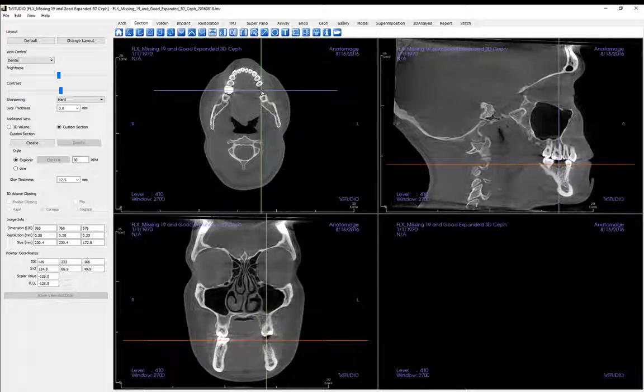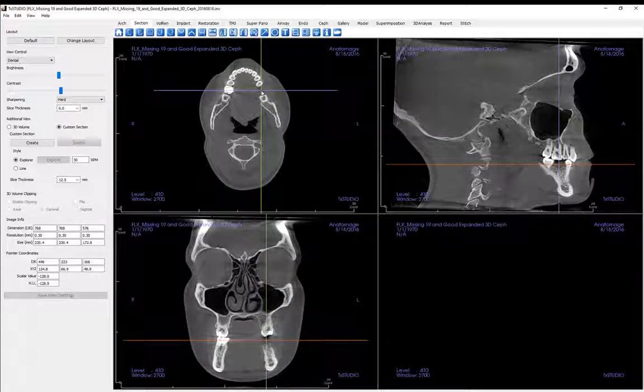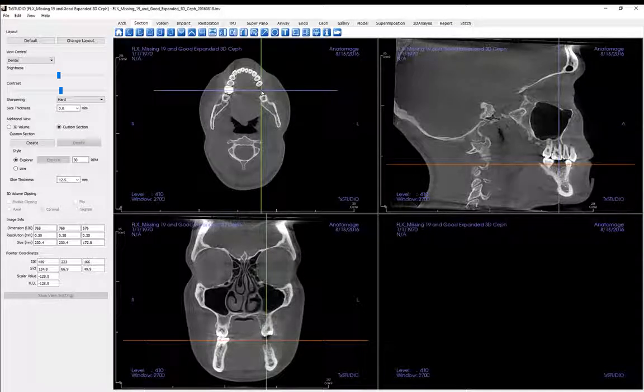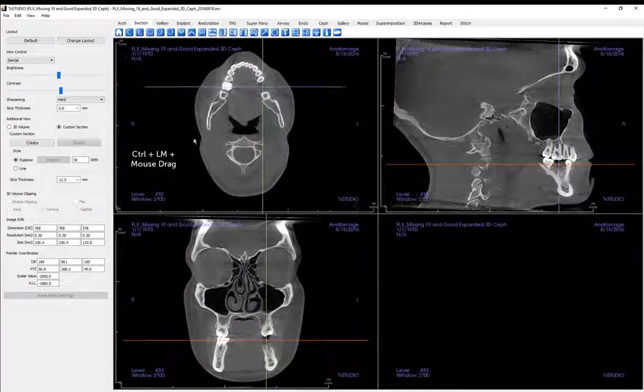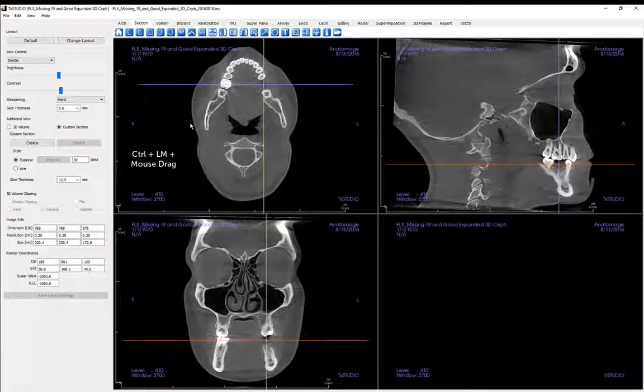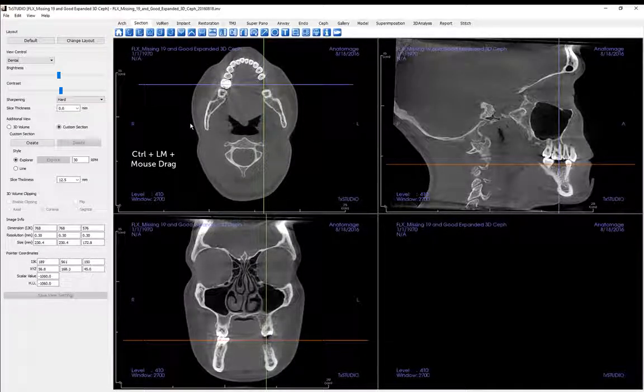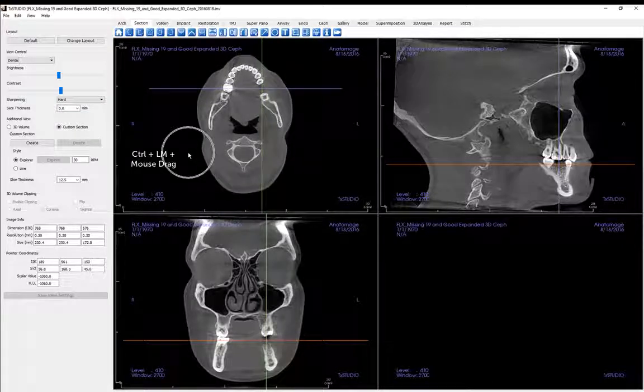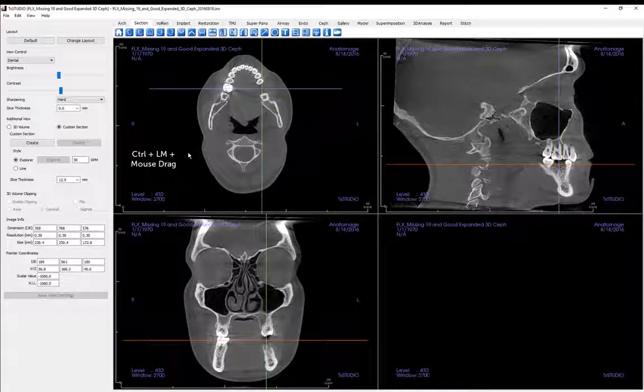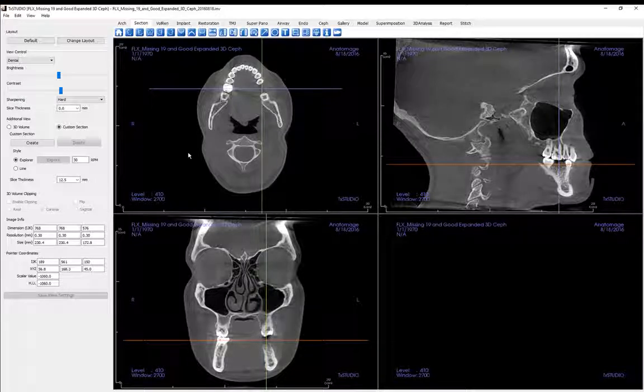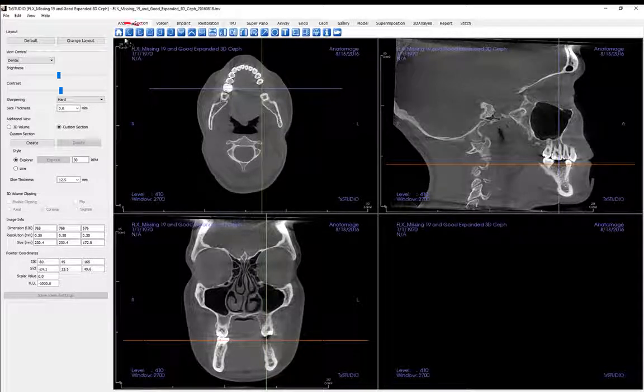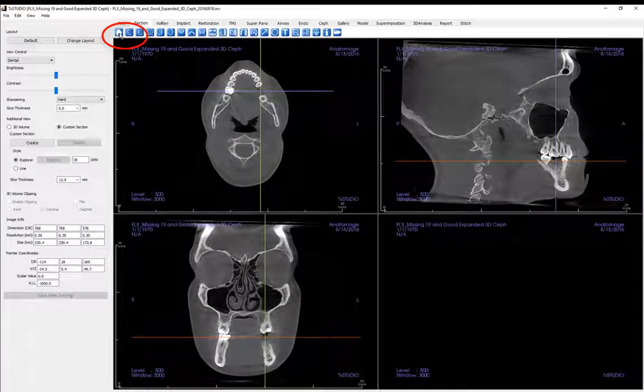You may find that you need to zoom in on the image for greater visibility. This can be done in two ways. First, move the mouse cursor to the desired image, depress the control keyboard key and left mouse button and move your mouse upwards. Move the mouse toward the bottom of the screen to zoom out. To quickly revert to the default view, click the Reset icon on the toolbar.